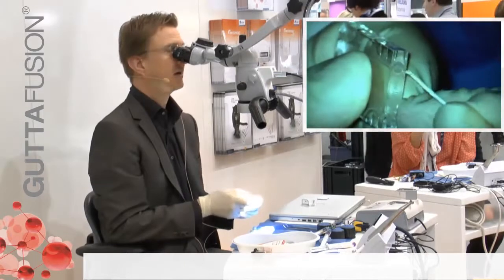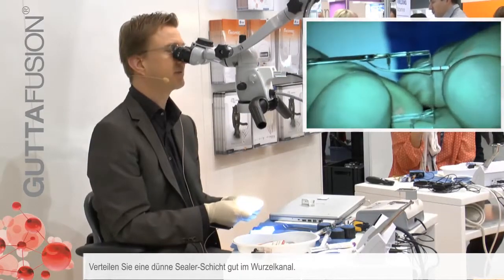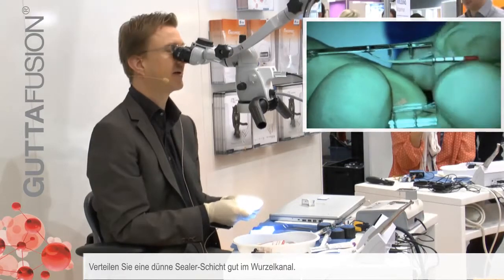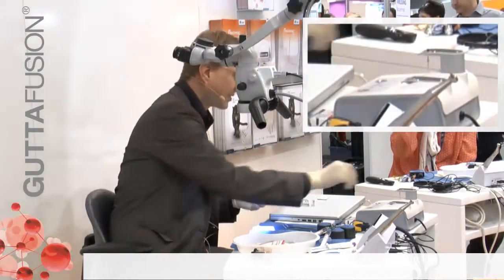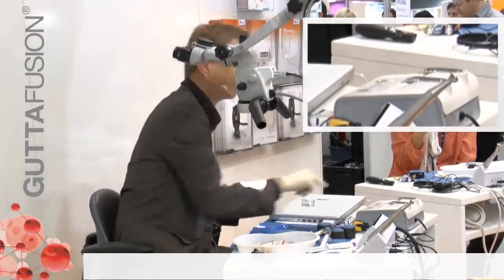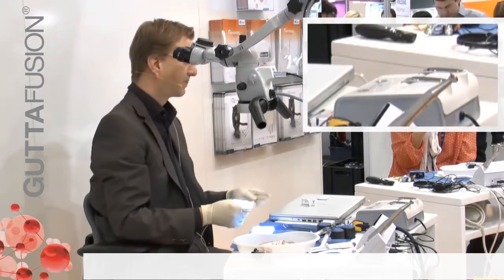So let's say I am obturating this. I insert the paper point and place the sealer in the root canal, and you can see it is a thin layer of sealer. We need mostly Guta Percha — only very, very little sealer. I now heat the obturator.